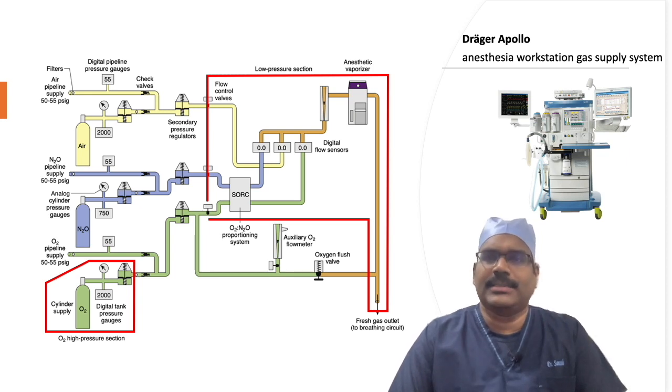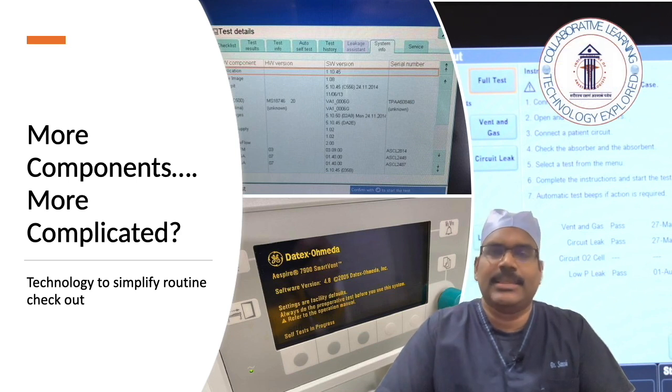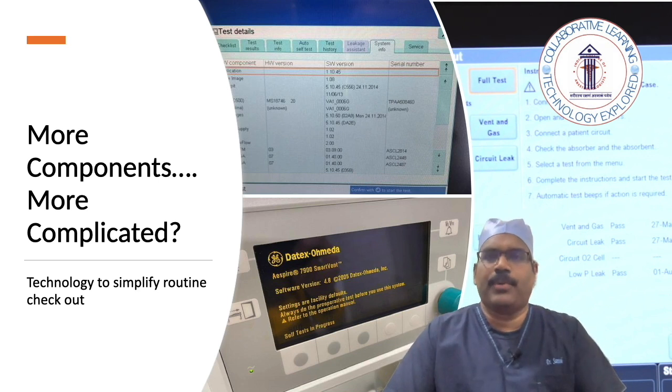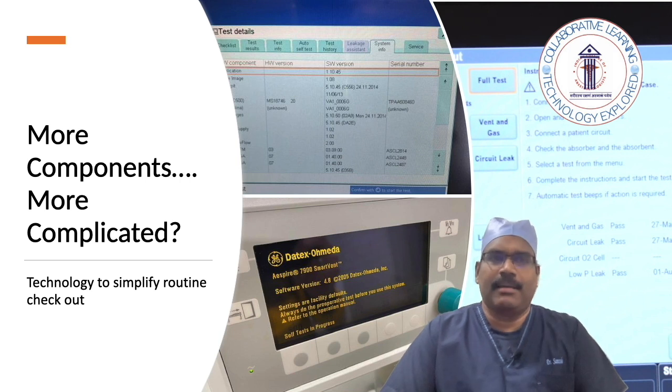So the universal dictum is: know your machine well before using it for patient services. Our theme of the day is Modern Anesthesia Workstations, Sophistications and Safety Features. And if you start thinking more components means more complicated, the answer is no. In fact, all the advancements are made to make the workstation more user-friendly and with improved patient safety measures.